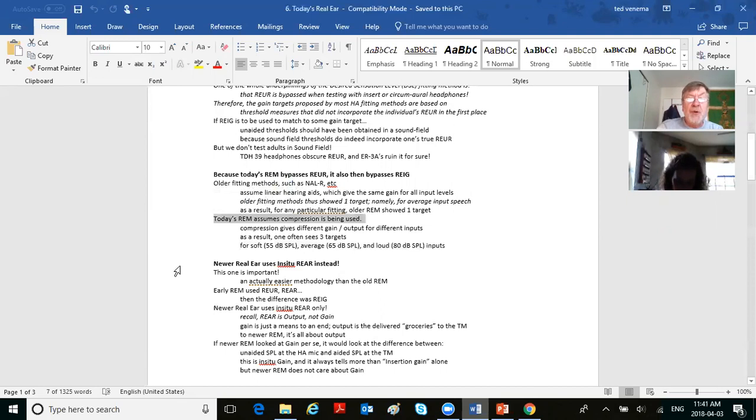So newer real ear uses only one of the 3 acronyms we studied last week. REUR, throw it out the window. REIG, throw it out the window. The only one used is real ear aided response. Oh yeah, look at this. The thumb, the forefinger, and of course the bird. Real ear insertion gain, out. Real ear unaided response, out. Real ear aided response, yep, that's the one you want.